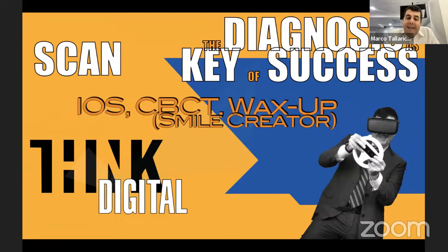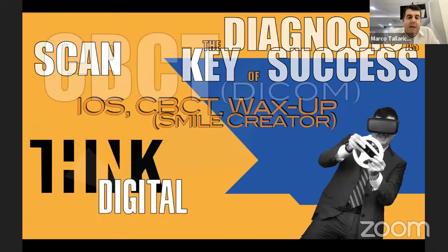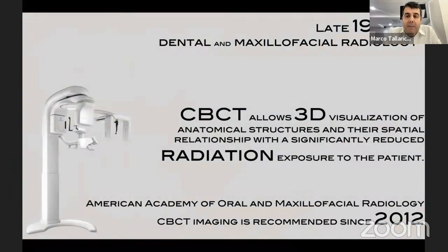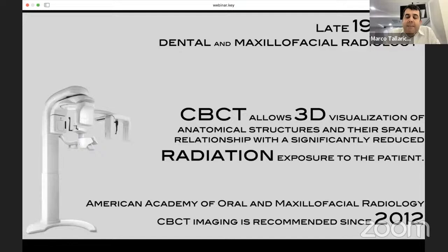However, today I will show you some cases on natural teeth and some cases on implants, because I want to introduce these 3 concepts. Starting from the CBCT scan means DICOM files that we need to import in our software to make the diagnosis looking at the radiographic anatomy of the patients. The CBCT scan was introduced in the late 1990s in the dental and maxillofacial field. CBCT scan allows us to see the 3D visualization of the anatomical structure of the bone and the relationship with the important anatomical structures. Different from the CT scan, the radiation dose is lower for the patients.